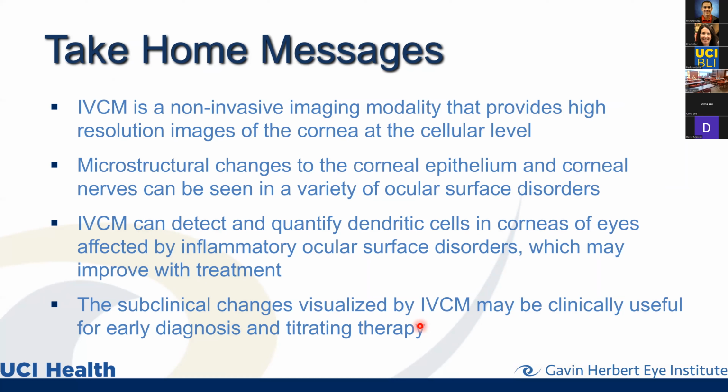And we can use confocal to detect and quantify the presence of dendritic cells in eyes affected by inflammatory ocular surface diseases. And that dendritic cell density improves with treatment. So maybe we can use these in the future clinically for early diagnosis, titrating therapy, and my hope is one day we can use it to prevent disease.